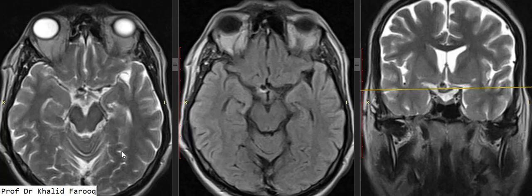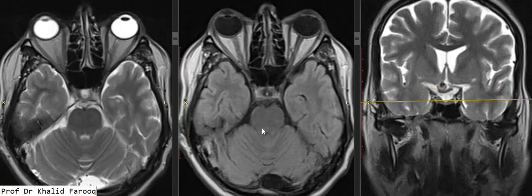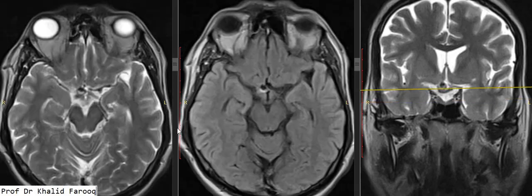We have T2 FLAIR and coronal T2 weighted sequence. On the axial FLAIR sequence we can see the optic nerves, medial and lateral rectus muscles, eyeballs, ethmoid air cells, and this is the pituitary stalk and pituitary fossa.